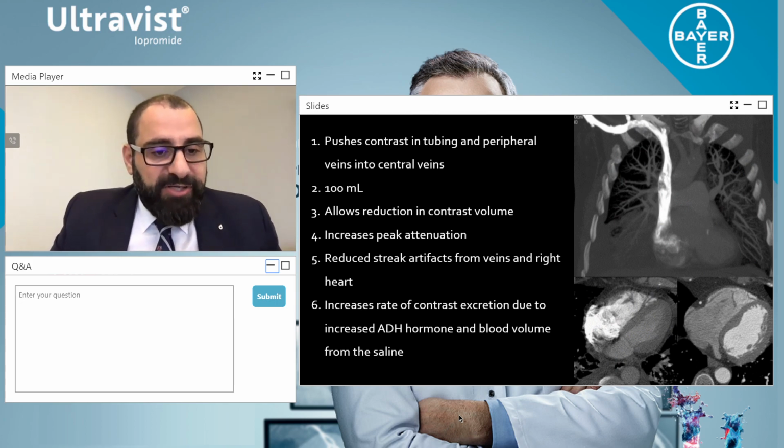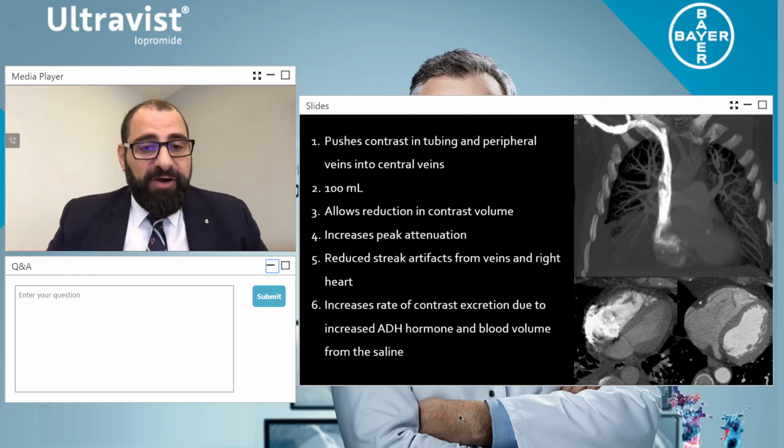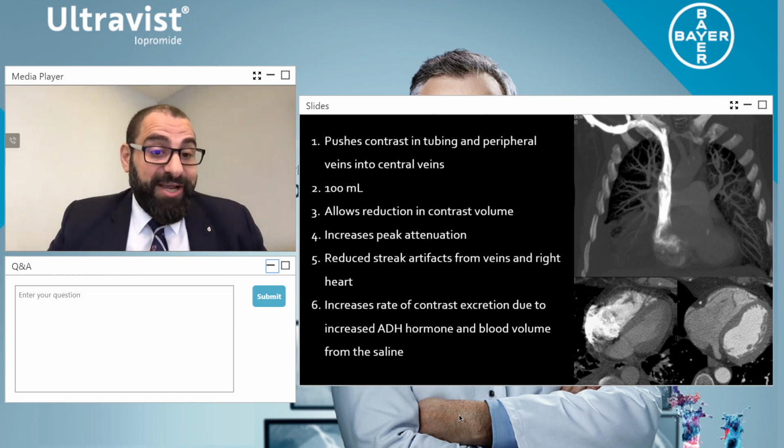Now I have another question of Samuel Underhill. Do we use the same flow rate of contrast as saline? Absolutely yes. Now you can be technically even more perfect. If I have a contrast media delivery injection rate of contrast at 3.5 mils a second, I would push that to 4.5 mils a second for the saline injection.